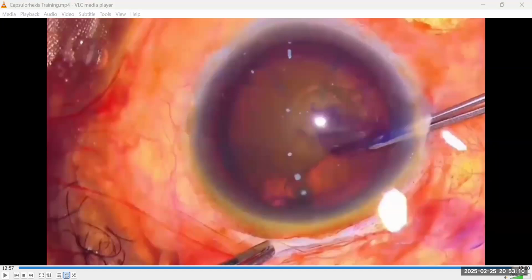Now, I was discussing with Mustafa and I shared a concern with him. Every surgeon, because cataract surgery is for every ophthalmologist before we start diversifying. What if you have to put your capsular tension ring? How will you put it with a can opener?